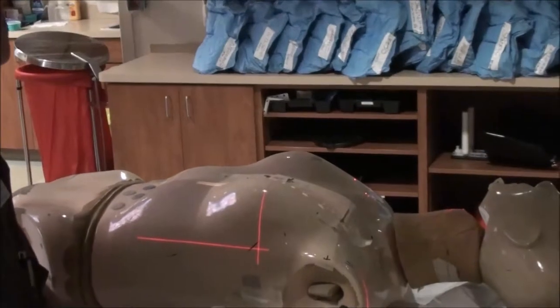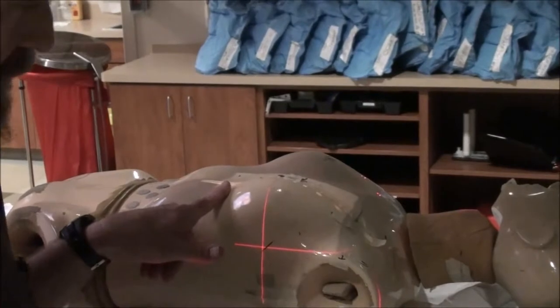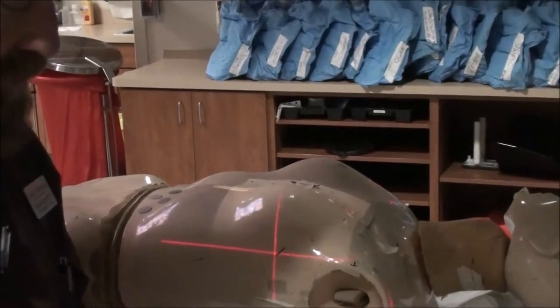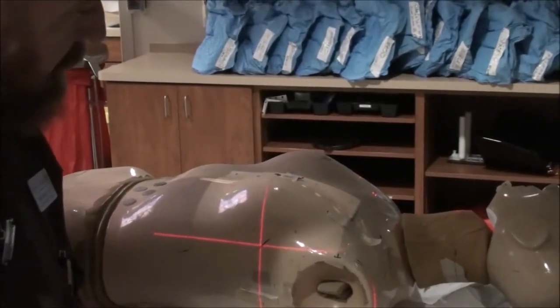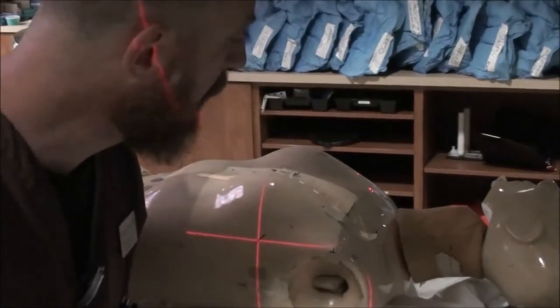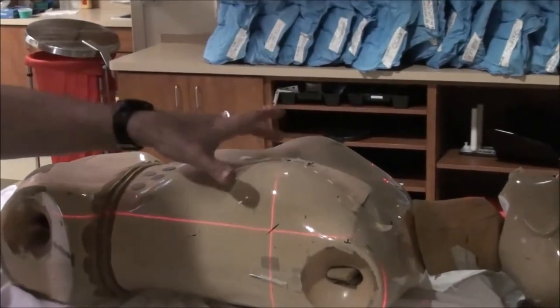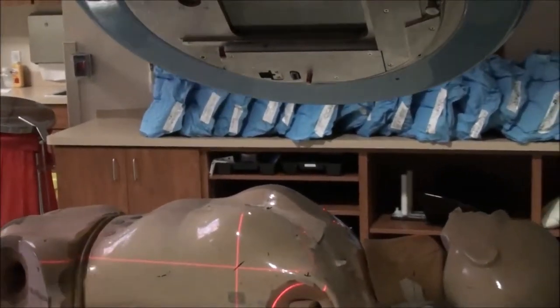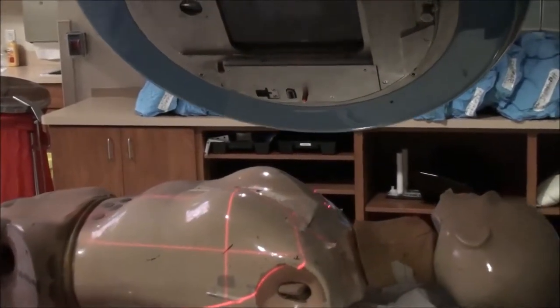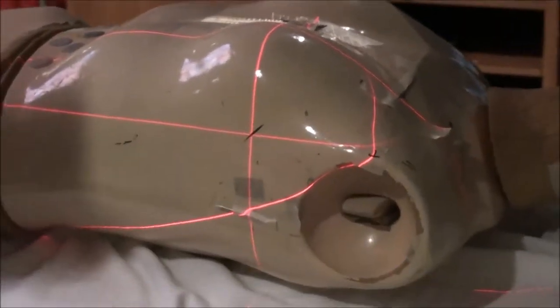I've got just a little bit of a gantry kick already. I'm going to give myself one to two centimeters flash from the inferior aspect of the inframammary fold. Open the field size again — you'll notice you have to walk this back and forth; it's kind of an in-out stair step. I've got the top of my field ballparked to the wire, I've got my flash, I've got my width. I'm going to go ahead and rotate my gantry about 45 degrees off — it's usually going to be more than 45 degrees — until my CR is on my medial wire and my back pointer is on my lateral wire, which the doctor placed.